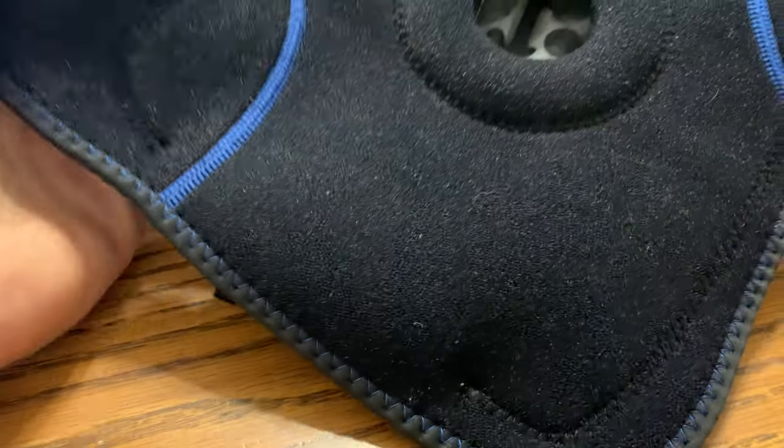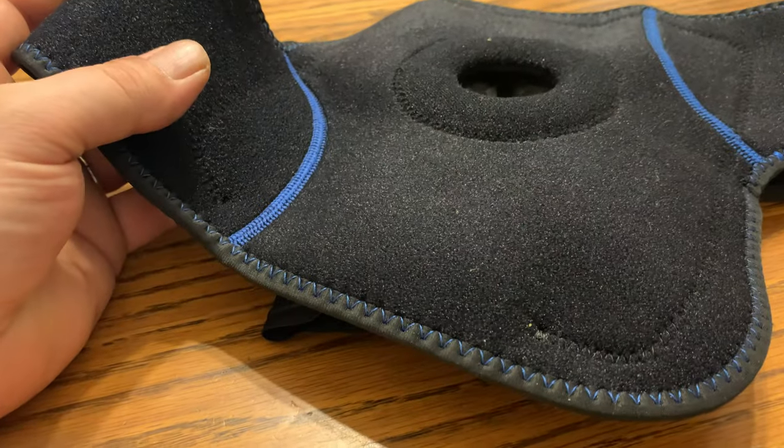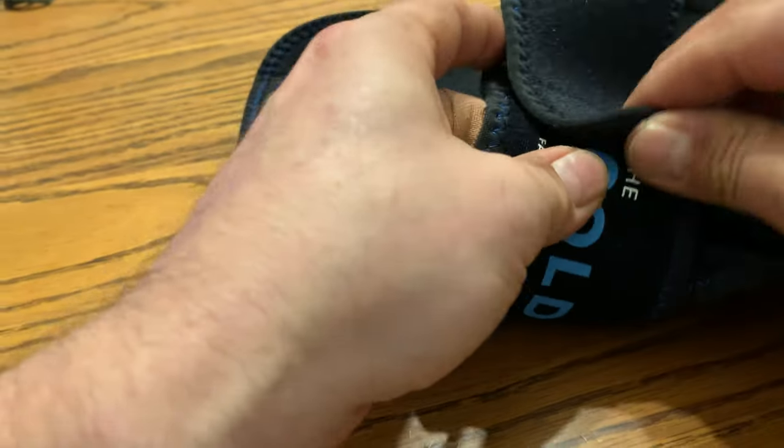And that works well. It keeps cold for about 20 minutes, and that's about as long as you want to keep it on your knee, because you don't want to over-freeze your knee either.